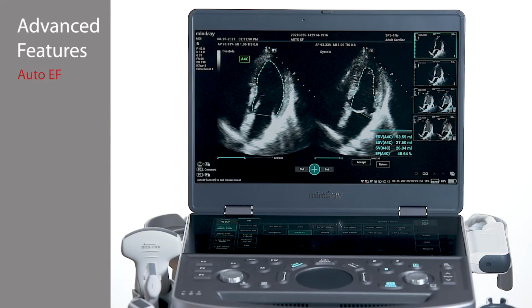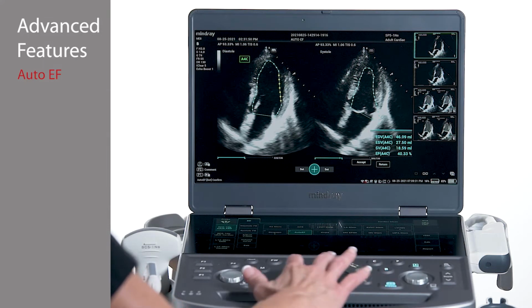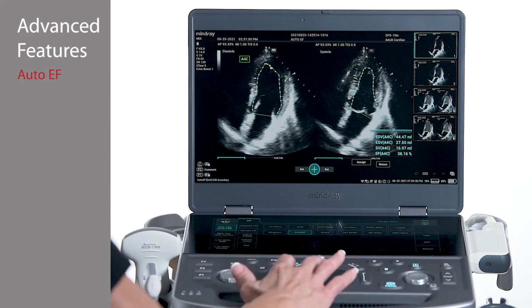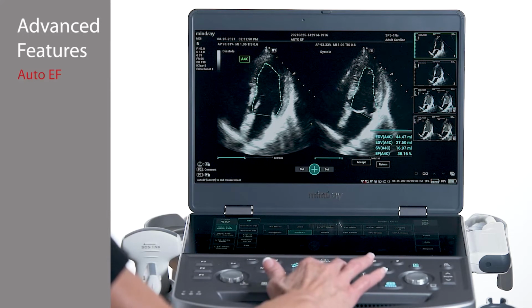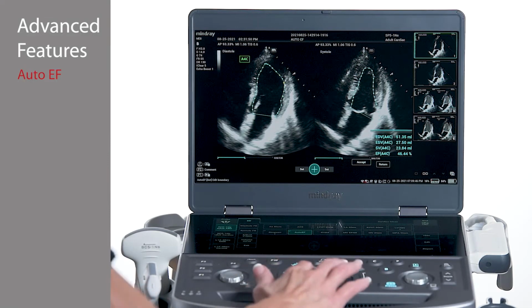To adjust the placement of the tracing point, use the cursor and trackpad. Place the cursor near the image and a section of the points will turn yellow. Touch the trackpad or use the set keys to grab the points and drag them to the desired position, then tap to release. On the touch panel, there are additional control options.